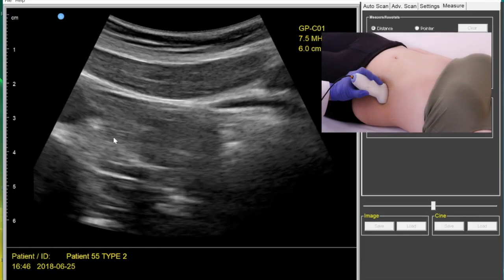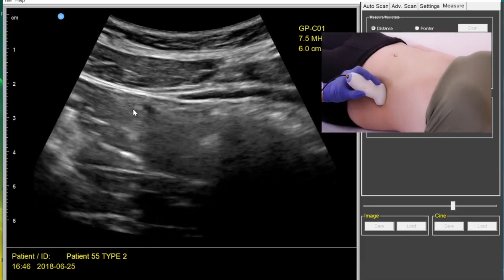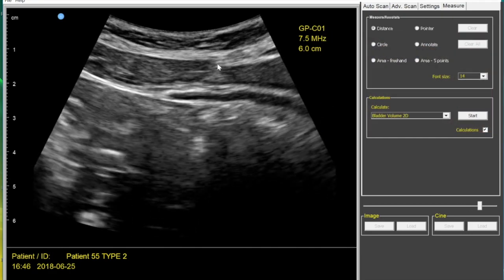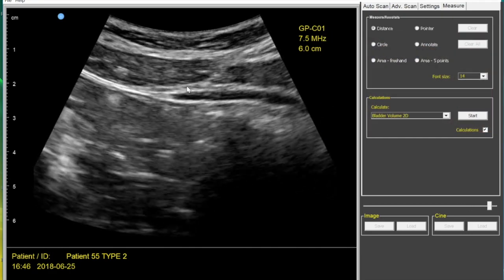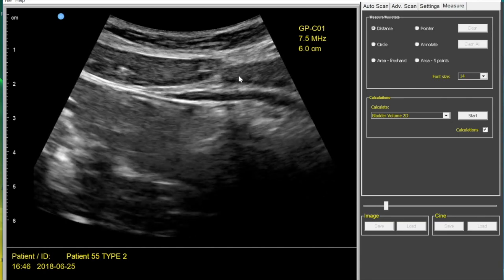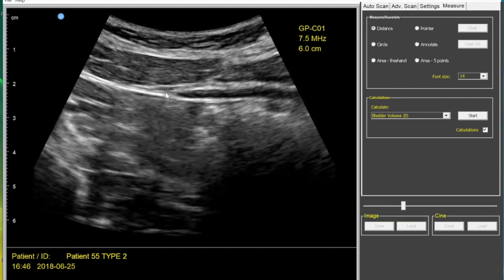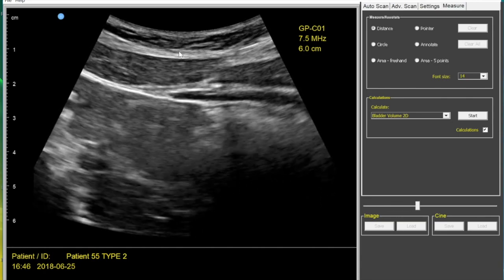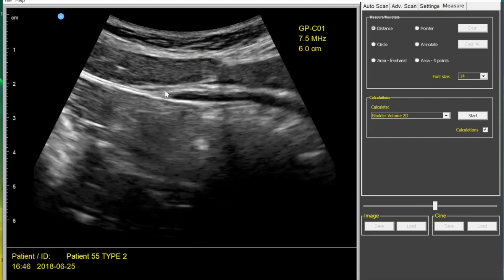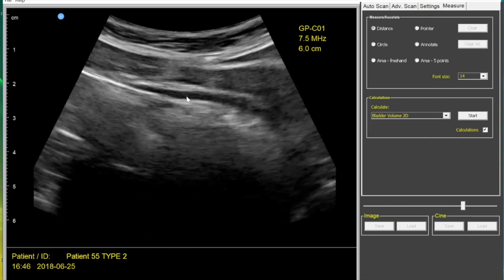Find your rectus and slide over. This is called the linea semilunaris, which is where we make the transition from the rectus into the lateral obliques. You can see how that curves around there — that's the linea semilunaris, and then that is your TA.